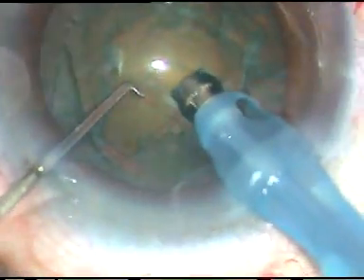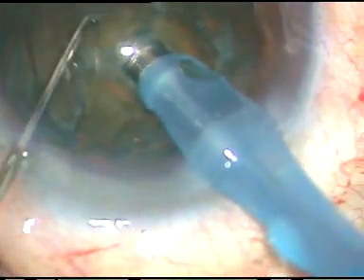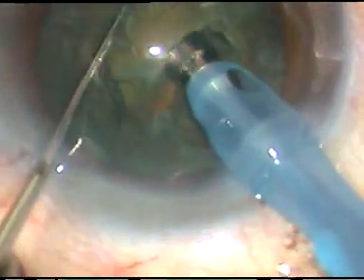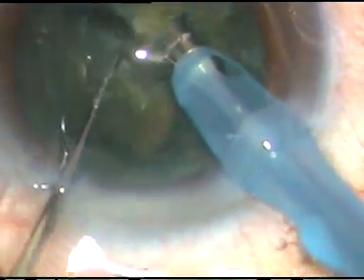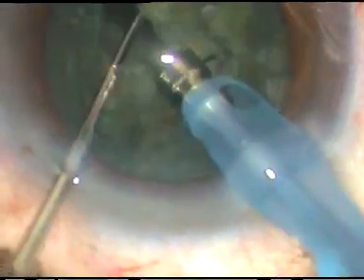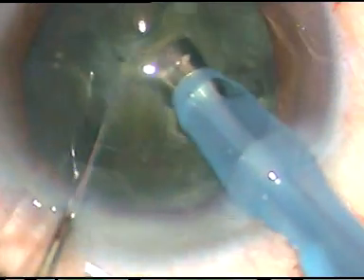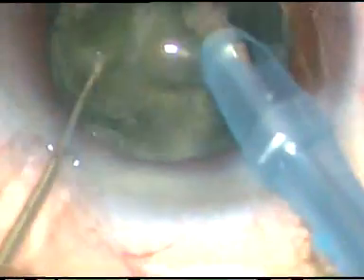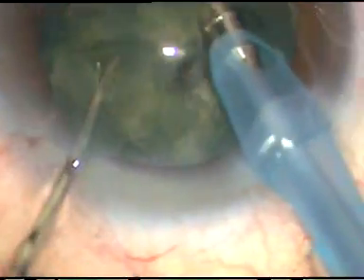Dear colleagues, in this video I want to show direct chop and the use of the Posterior Capsule Protector. The Posterior Capsule Protector is an instrument which has been designed by me for prevention of posterior capsular rent during emulsification of the last nuclear fragment.